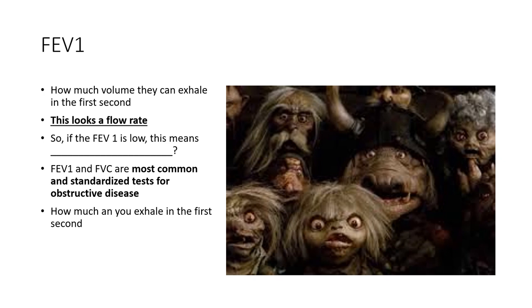FEV1. Now we're starting to get into flow rates. FEV1 is the forced expiratory volume in 1 second. I'm going to have you take a deep breath in and blow out really hard and fast, just for that 1 second. That 1 second tells us how much volume they can exhale in the first second. Looking at volume over time, which is the definition of flow rate, FEV1 is a flow rate.